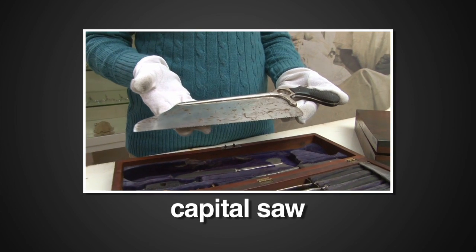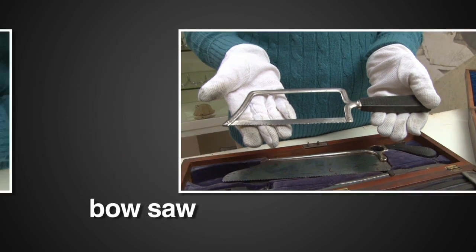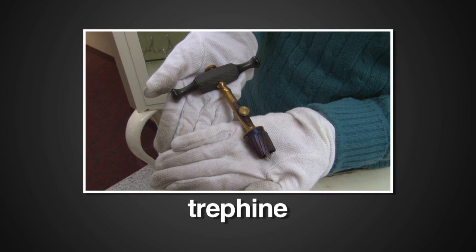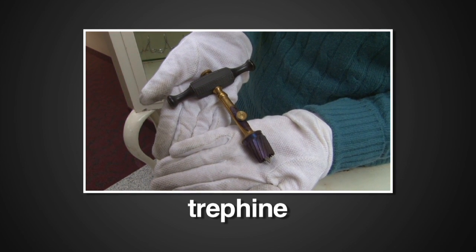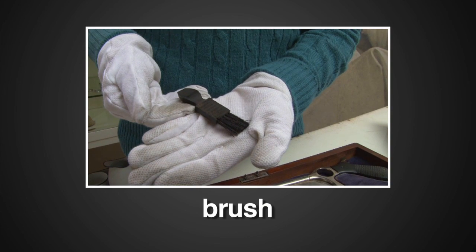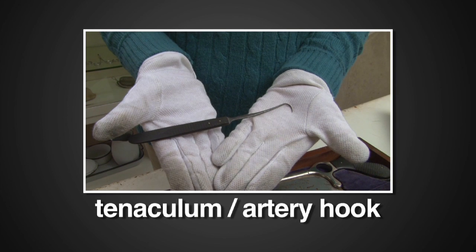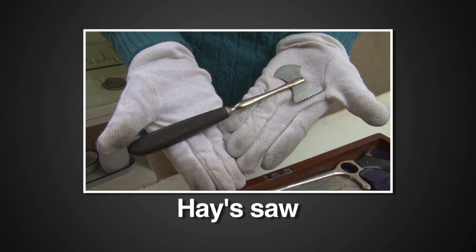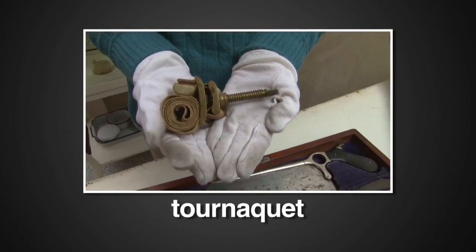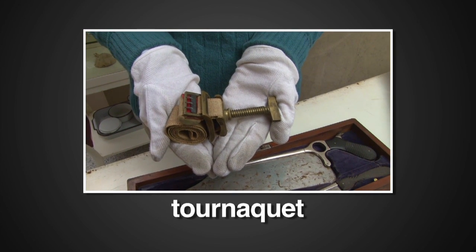So let's look at what these kits usually included. The capital saw, used to cut large bones. The bow saw, also used to cut large bones. A trephine is a hand-held drill used to relieve pressure under the skull or repair depressed fractures of the skull. This is the brush used to clean the teeth of the trephine. The tenaculum or artery hook holds arteries at the amputation site so they can be tied off. The hay saw is used to prepare a skull in the trephining procedure. A tourniquet — this is a brass screw type used to cut off blood circulation to the injury site before the surgery.